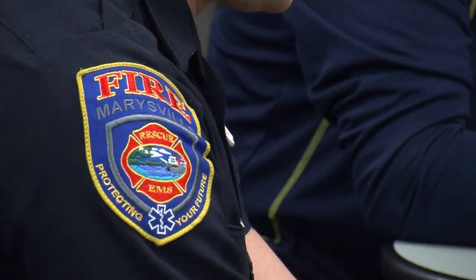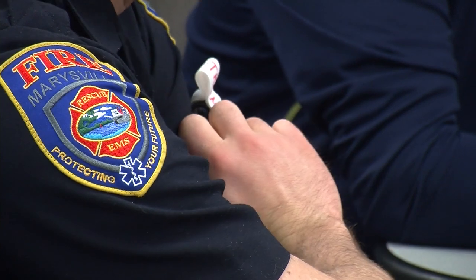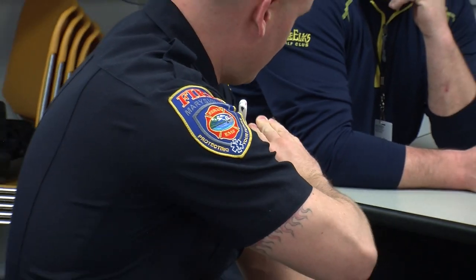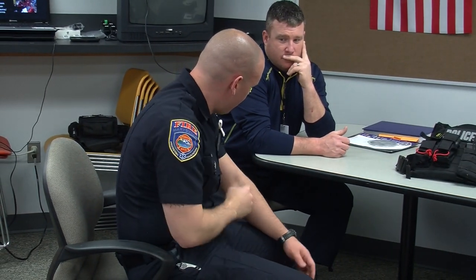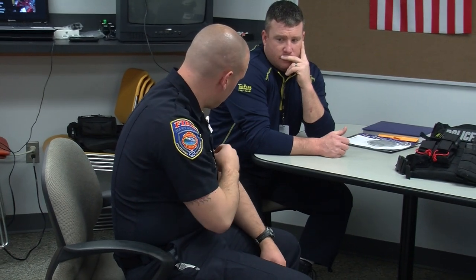And if they had some kind of major bleeding, some kind of arterial or life-threatening bleed, put this thing on and you just tighten this down until the bleeding stops. There's a half turn. There's a full turn. And there's no pulse. You have to stop all bleeding. Not just the bright red, but everything, period. And you can leave these things on for a long, long time. And I'll show you more detail when we look at some of the pictures on there.